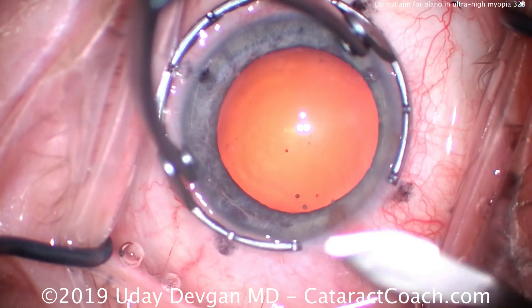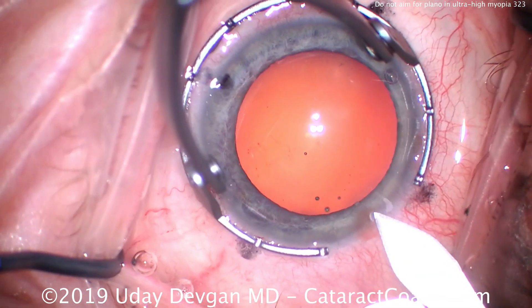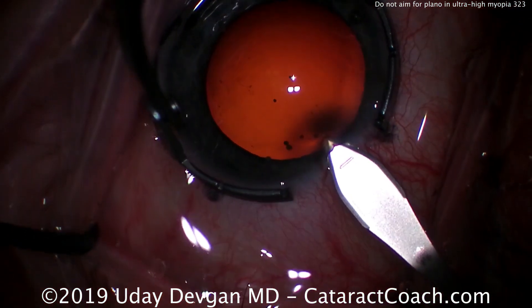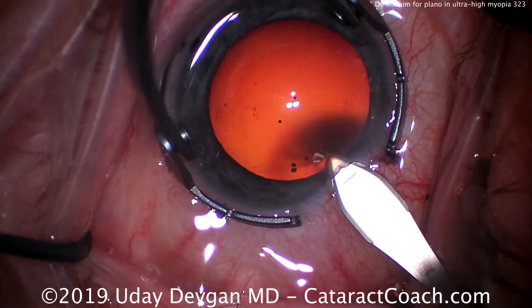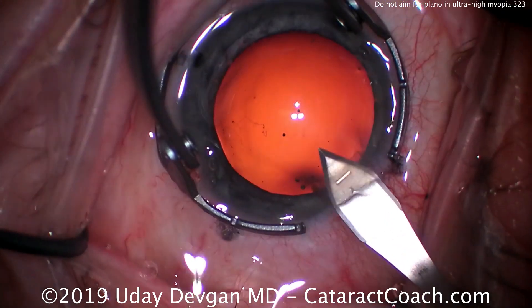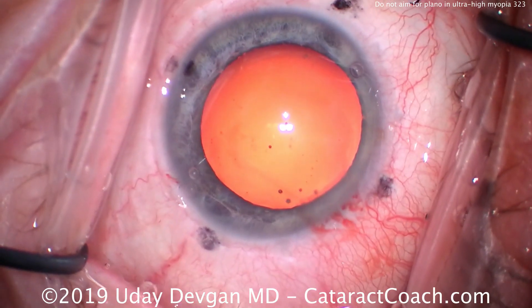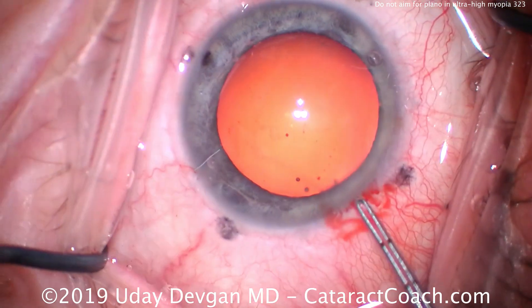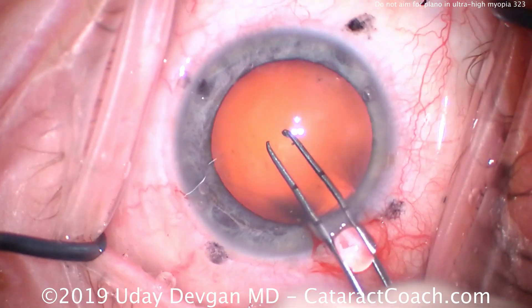Here's a cataract surgeon dealing with a very myopic eye. The first giveaway is how big the white-to-white is compared to the fixation ring. The fixation ring has a diameter of 13 millimeters, and this cornea fills that completely — so you're looking at a white-to-white measurement of about 13 millimeters. That's a big cornea, a big eye. Axial length is well over 30 millimeters.